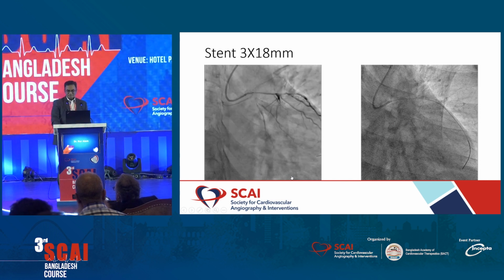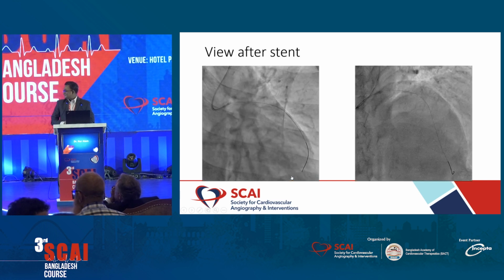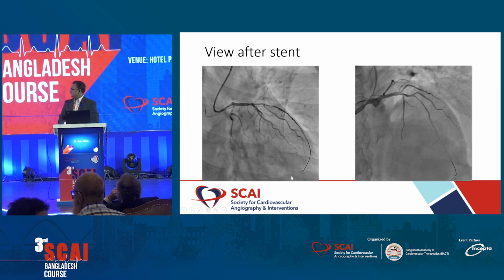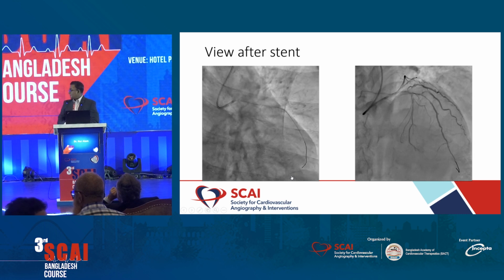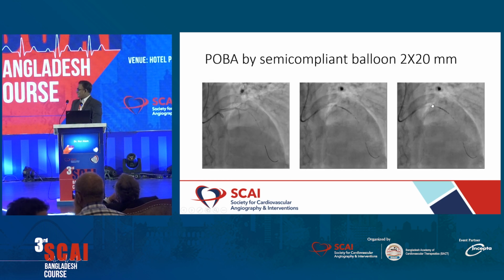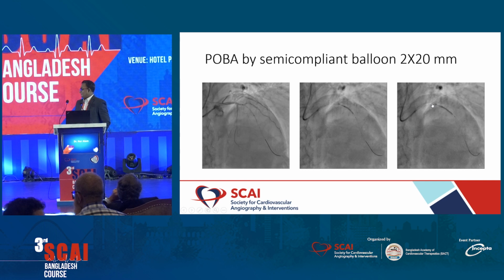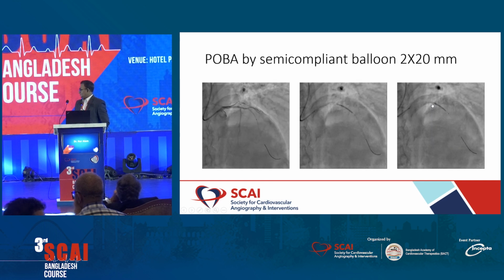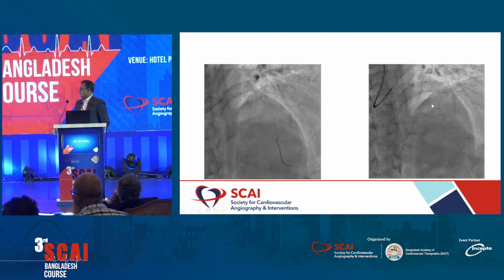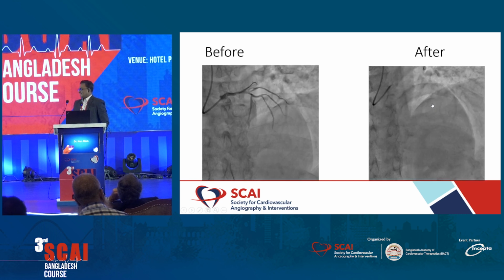Thank you, Dr. Nur Alam, for your brilliant three cases. In your first case, you have done with DCB, excellent result. Adequate size DCB, in-stent restenosis, nowadays we use, but due to the lack of DCB, we can't use. In your third case, that was another case for mid lesion DCB, proximal lesion stent. In the second case, you have done very nicely distal DCB and proximal stent, but you did not address the first OM, which is also critical, and that is a big vessel. Thank you for your brilliant cases.